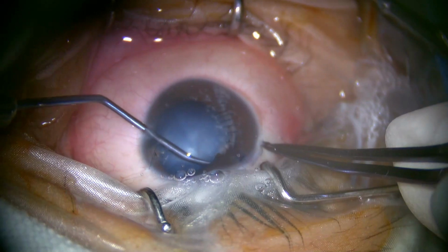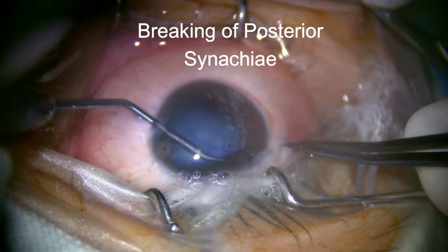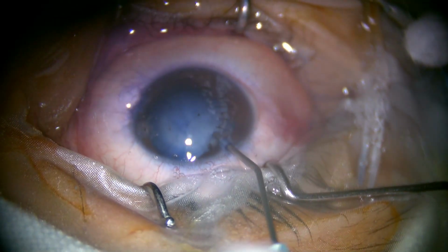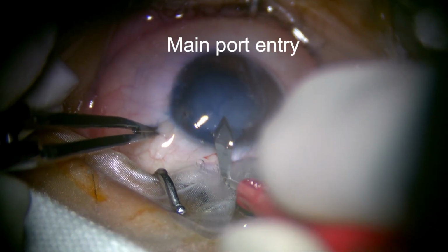The posterior synechias which were formed are cautiously broken down by this swiping movement. After that, anterior chamber is formed. Main port entry using keratome knife is done.